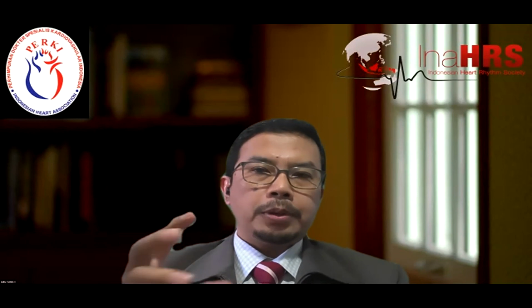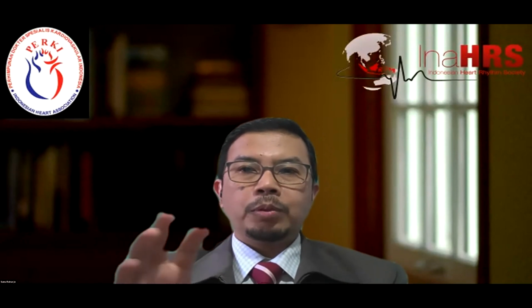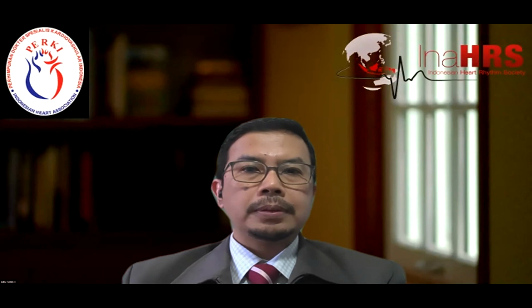So what is your approach when we have infrequent PVC, but very symptomatic, and then during the procedure, we cannot see it. It is difficult to map by activation mapping. What is your approach? So my approach really starts from the history of the patient.